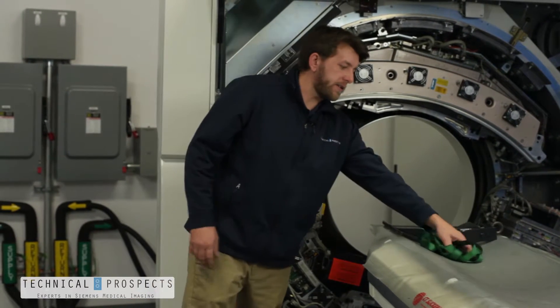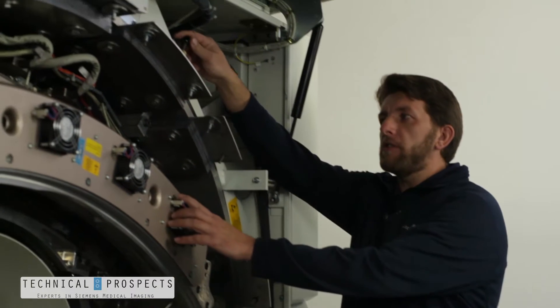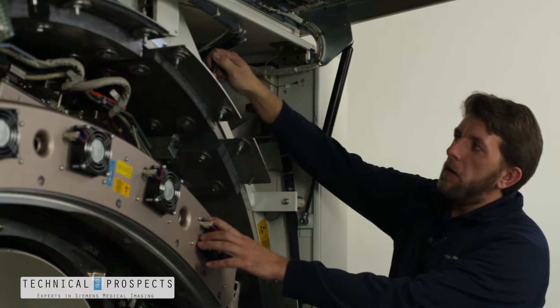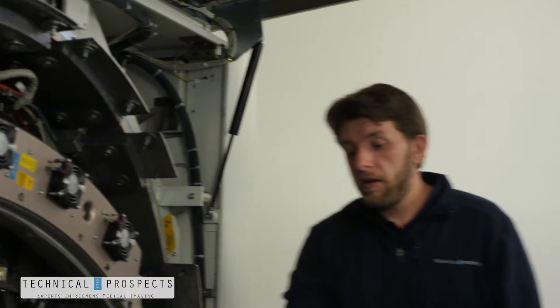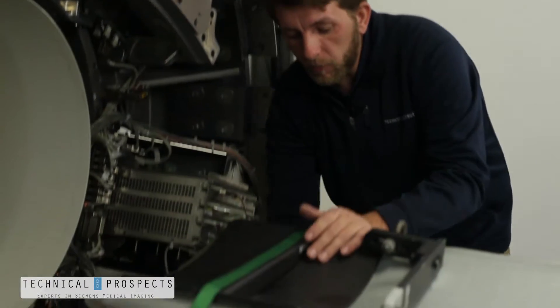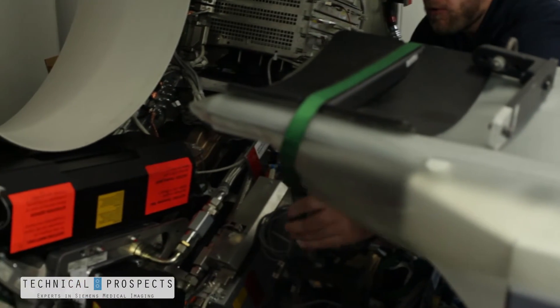At this point we're ready to attach the strap. Now that I have the tube assembly wheeled in place, one important key is to make sure your gantry is locked into place. The locking mechanism is up here on the top right of the gantry. Now with our plate here we can install the strap to the hook assembly.